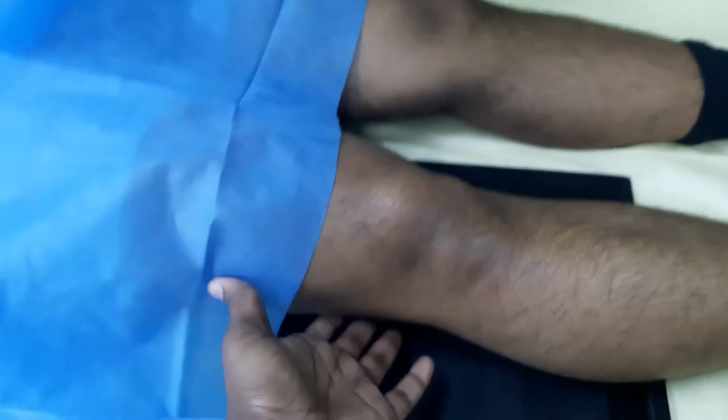So what you could also do is ask them to bend their knee slightly. So bend your knee, and you could estimate where the crease is at. Straighten the knee, straighten out the leg, right? When you line that up, it actually lines up to the apex of the patella. So you could just estimate there, right? But yes, half inch distal to the apex.